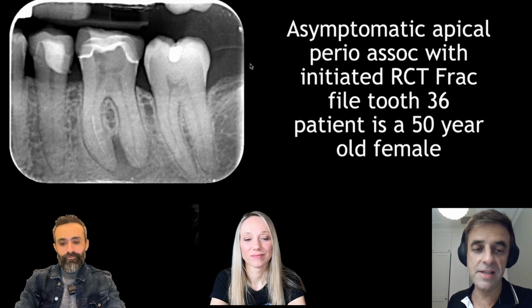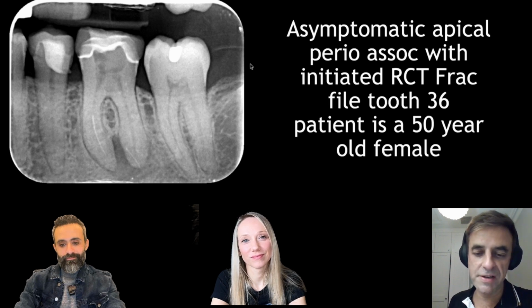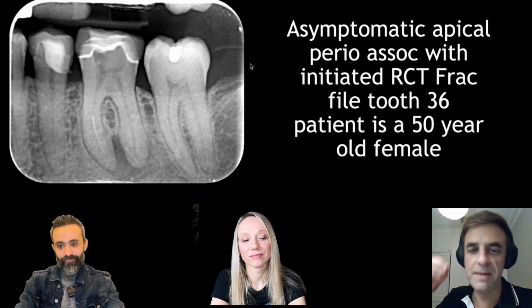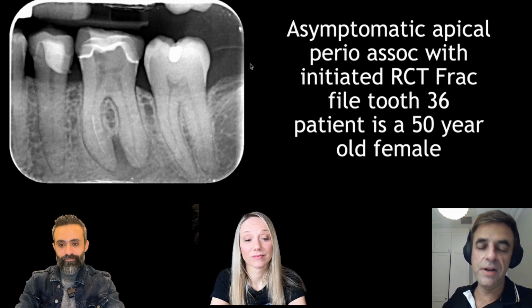There is one thing that I can see about this before. Obviously, the fractured instrument is pretty obvious, and the apical diseases are very obvious. But look at the conservative restoration on this tooth done by the dentist. Whoever did that was thinking smart, and they were very, very minimally invasive with this restoration. There's good pericervical dentine, and so this patient, if we can manage to clean out the root canals, has a good chance of keeping this tooth for a long time, and that's what we want in a 50-year-old patient.